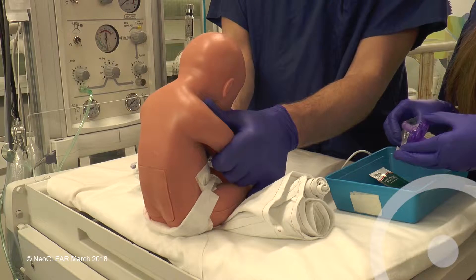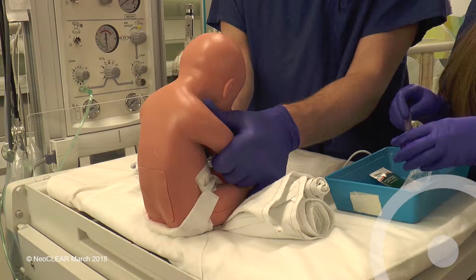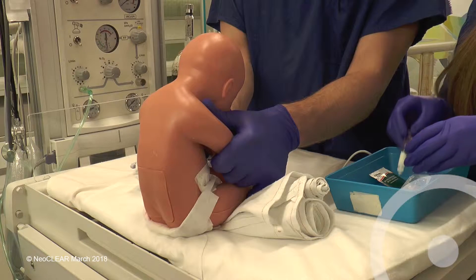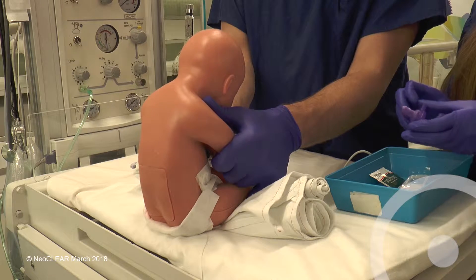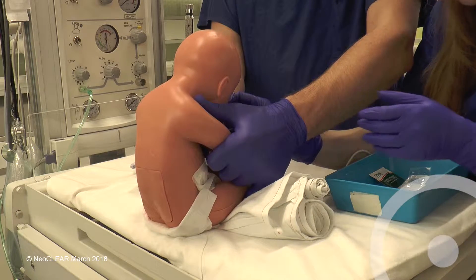The first assistant can relax their hold while the operator re-washes their hands and puts on the gown and sterile gloves. The infant may be given a few drops of milk or sucrose solution before the procedure and again during the LP if needed.